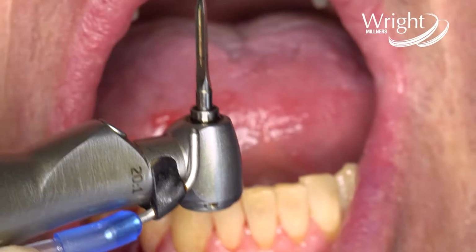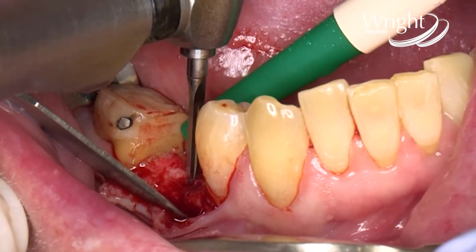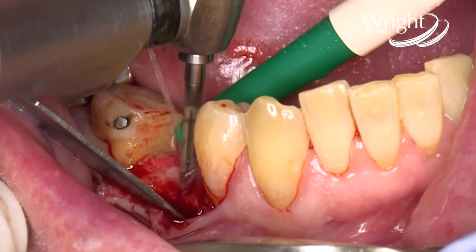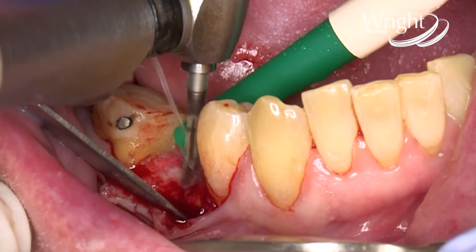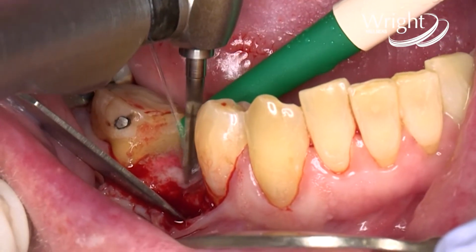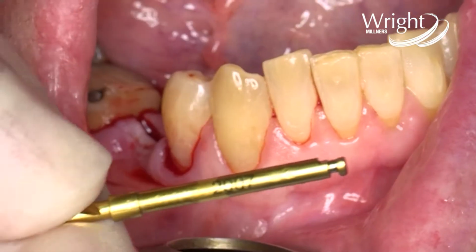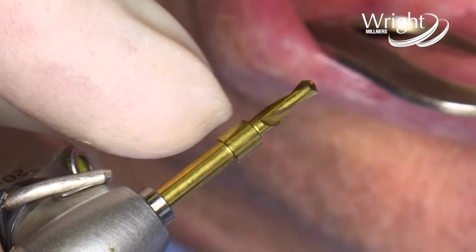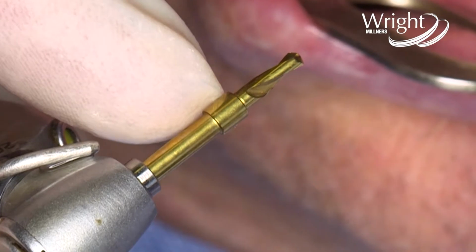Once we've done that, we're going to commence our drilling protocol. The first drill we use is our lance drill, and the purpose of this drill is just to perforate the cortical plate. The next drills we use are the pilot drills. As you can see, we start off with the 7mm. The beauty of the Megagen drills, which some others also have, is these stoppers.